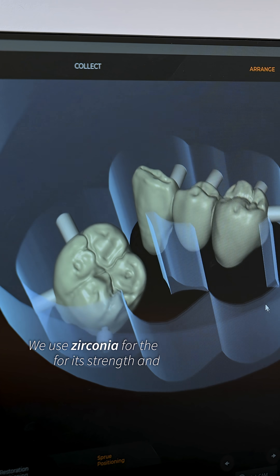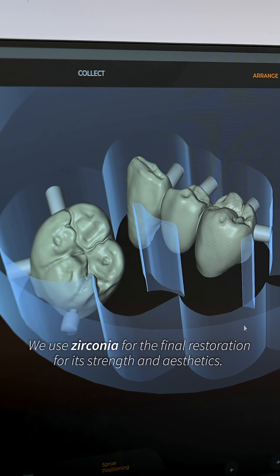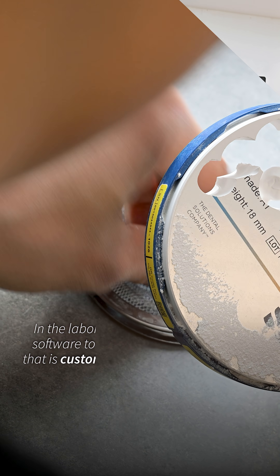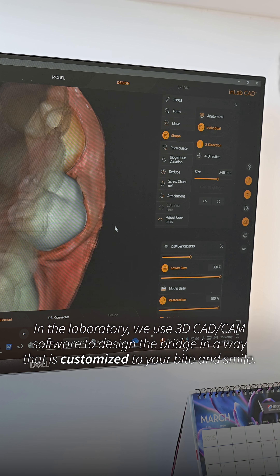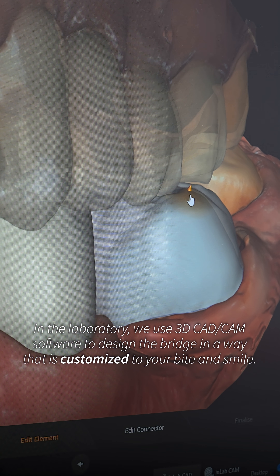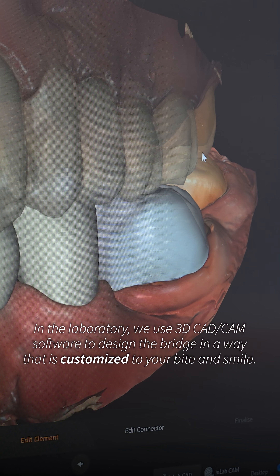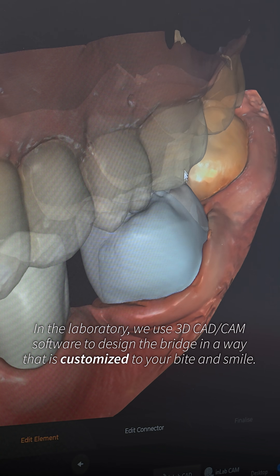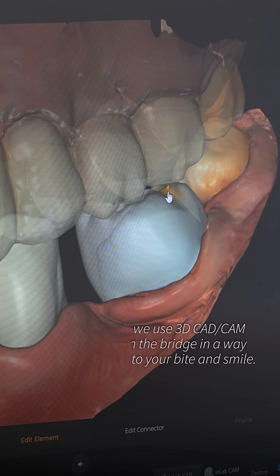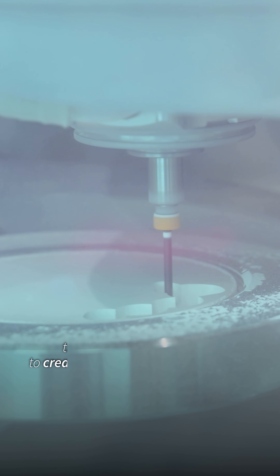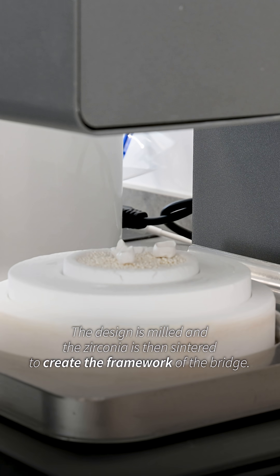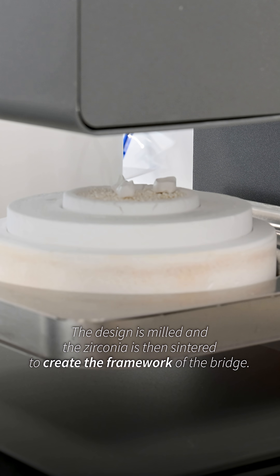We use zirconia for the final restoration for its strength and aesthetics. In the laboratory, we use 3D CAD/CAM software to design the bridge in a way that is customized to your bite and smile. The design is milled and the zirconia is then sintered to create the framework of the bridge.